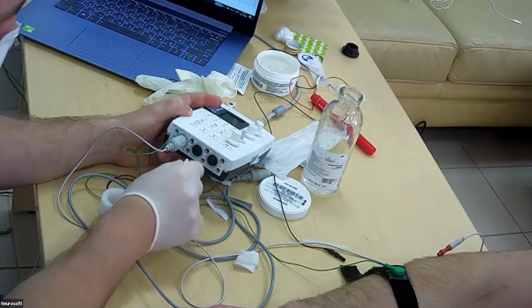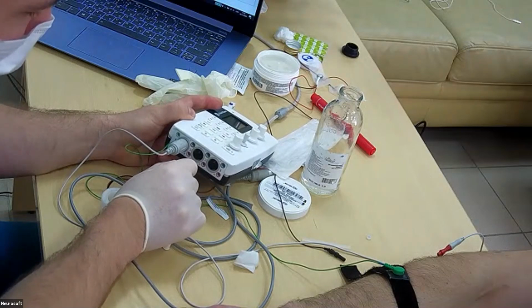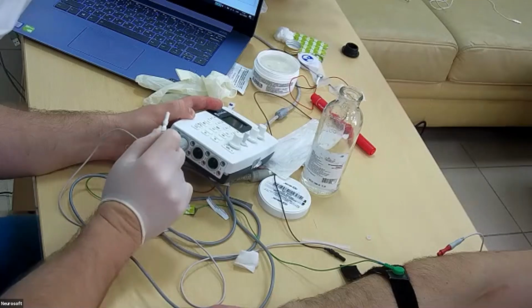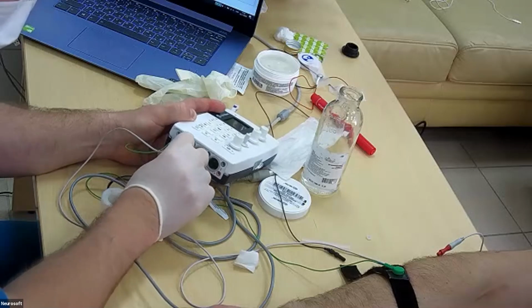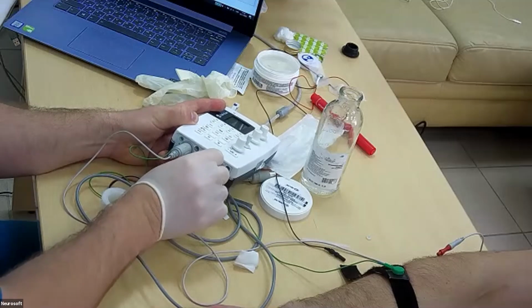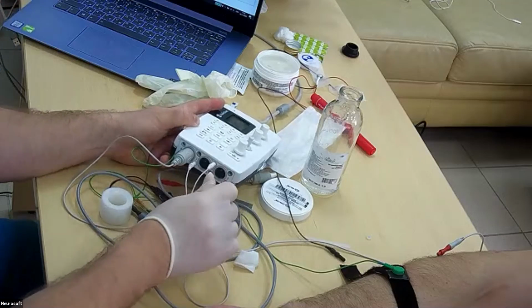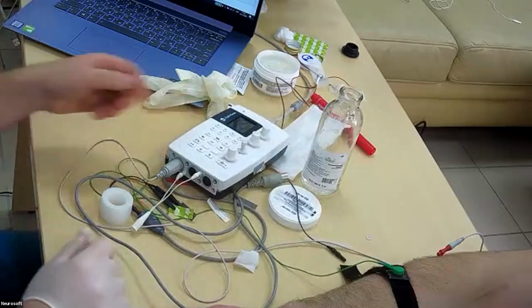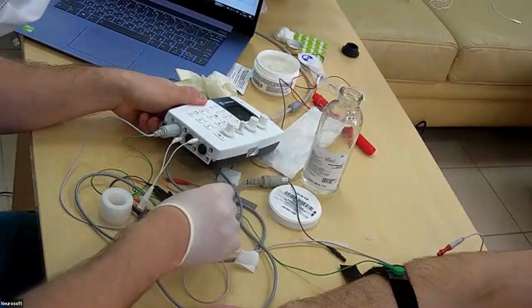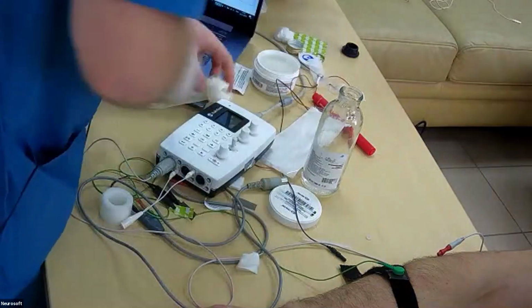So the cannula of the concentric needle will be the reference electrode for the first channel and the active electrode for the second channel. And the reference electrode for the second will be a surface electrode.